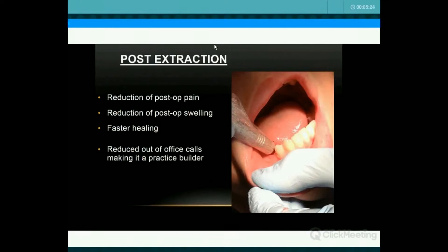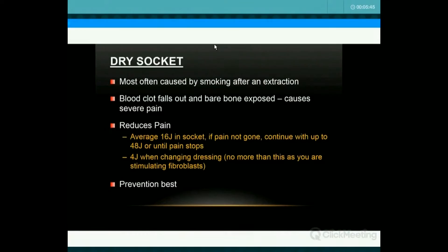If you've done an extraction, you want to apply it in direct contact. The patient's frozen — you put it right down into the socket. I'm using the intraoral tip, but with a wrap cover on it. You get faster healing and less pain. If you just had this one application, that would be enough to pay for the laser all by itself. It's that dramatic in effect.